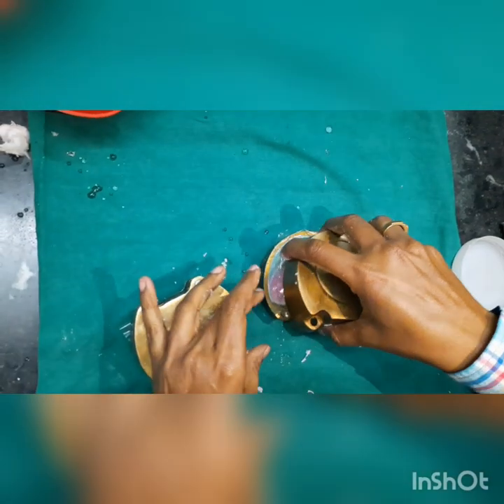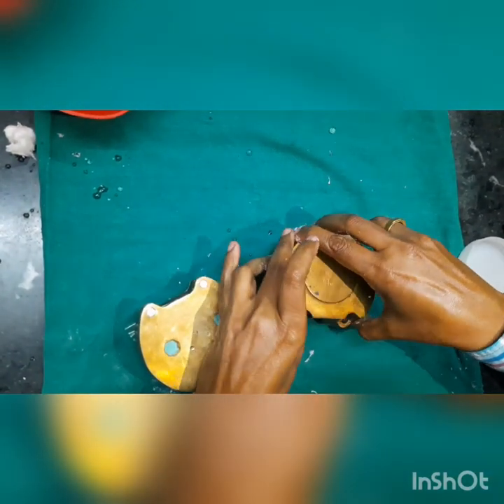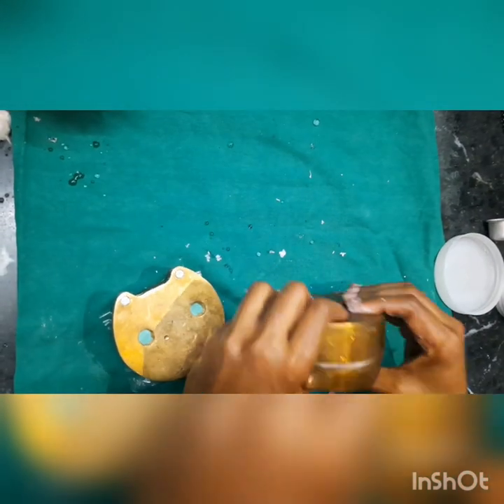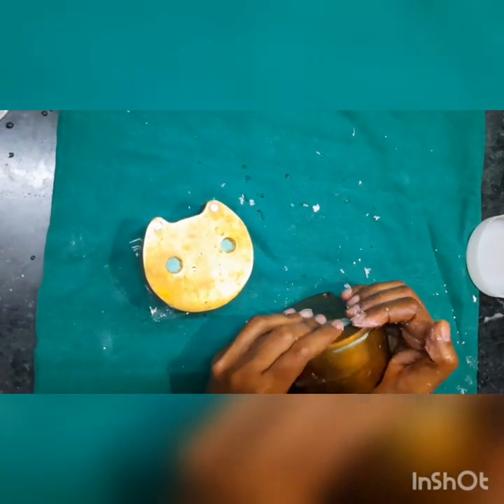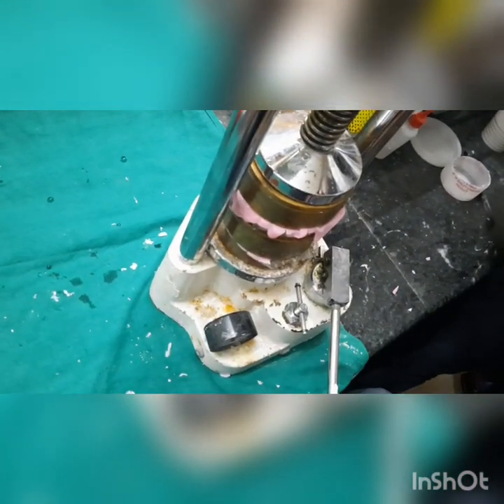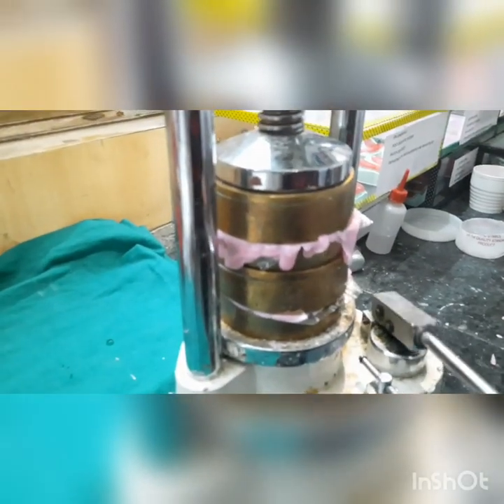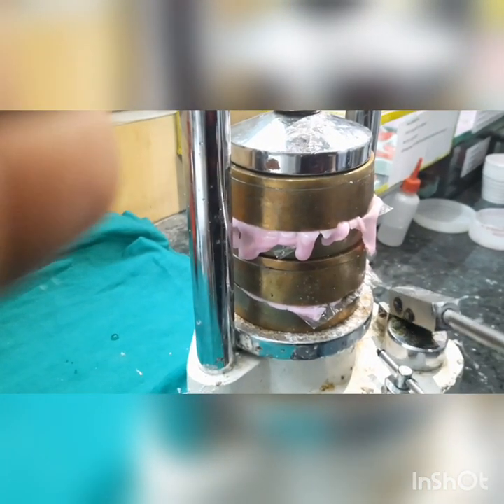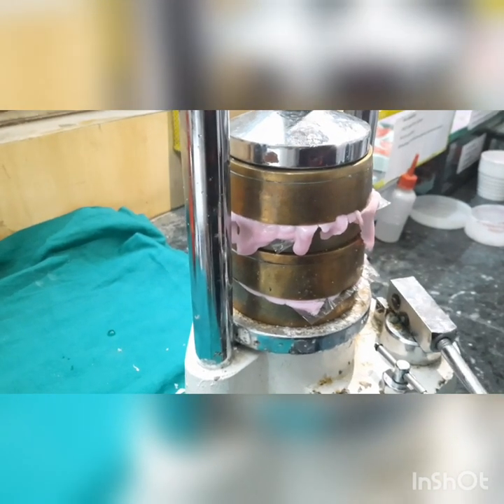Apply nicely — don't force it. We place it on the hydraulic press and apply pressure — not too much, but enough. You can see the excess material flowing out. This is known as flash, and it needs to be removed.